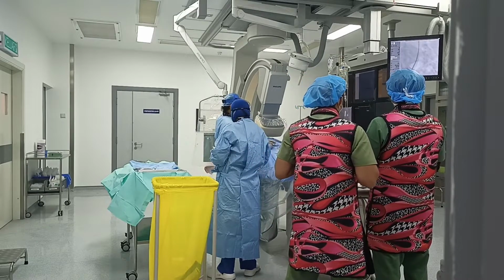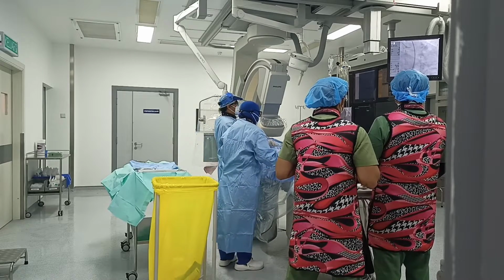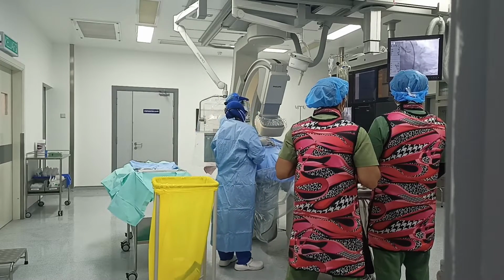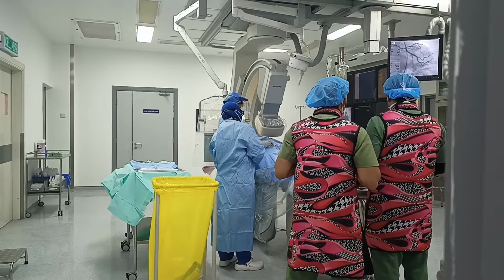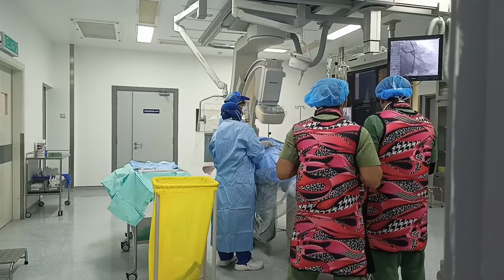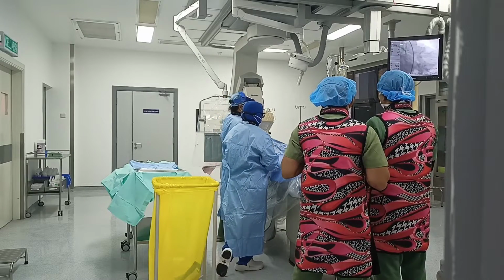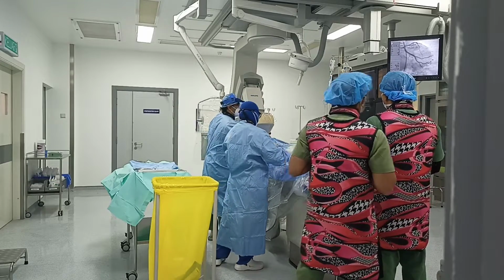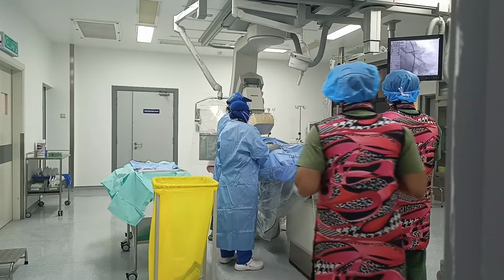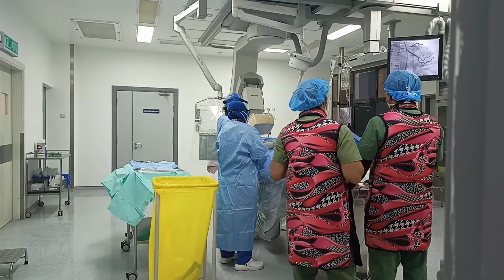He was duly persuaded to undergo a coronary angiography, and at coronary angiography, his right coronary seems like a dominant artery with long critical narrowing in the distal segment before bifurcation to the right posterior branch as well as the right posterior descending branch. This lesion, however, looked both bypassable as well as angioplastable.